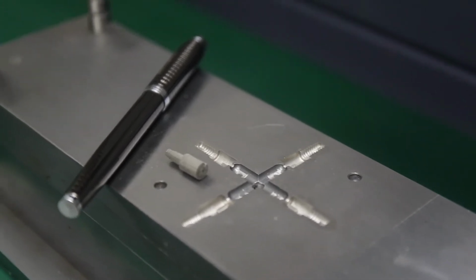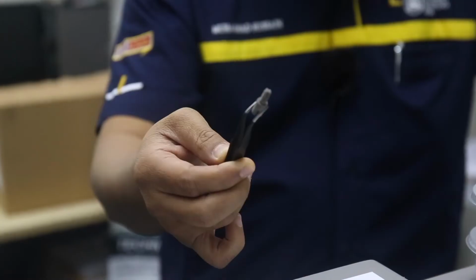These are examples of the NiTi green parts, from elemental powders, made using this metal injection molding machine.